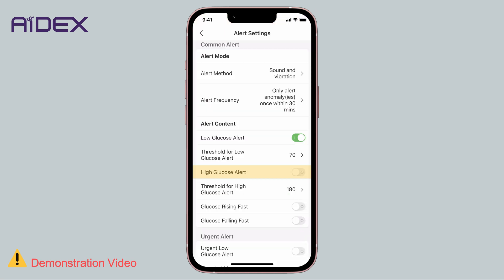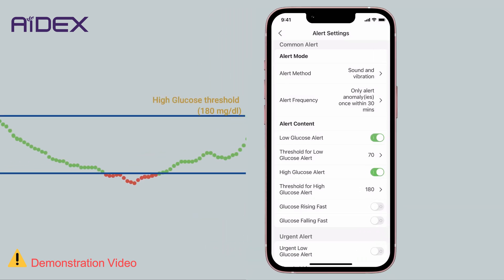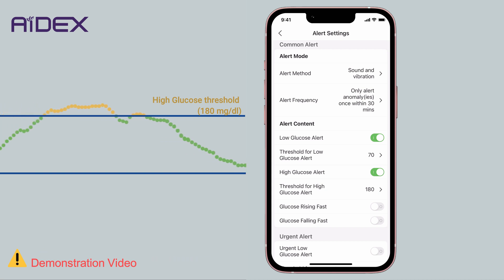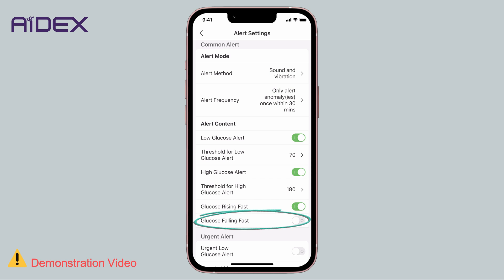Second, High Glucose Alert, which is the target range high threshold. You can enable or disable this alert and set the maximum allowable value in the same way. This alert triggers if blood sugar rises above this value. Third, Glucose Rising Fast — you can only enable or disable this alert, which activates if blood sugar increases at a rate of 2 mg per deciliter per minute. Fourth, Glucose Falling Fast, triggered if blood sugar decreases at a rate of 2 mg per deciliter per minute, and you can also only enable or disable it.